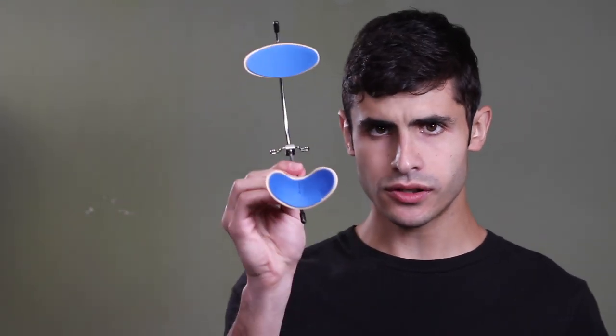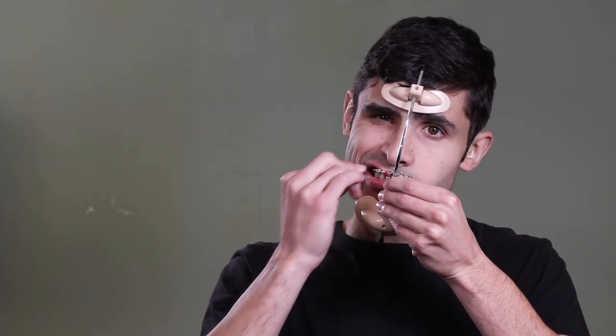And to put it on, you just take it, one elastic here, second elastic here, and there she is.